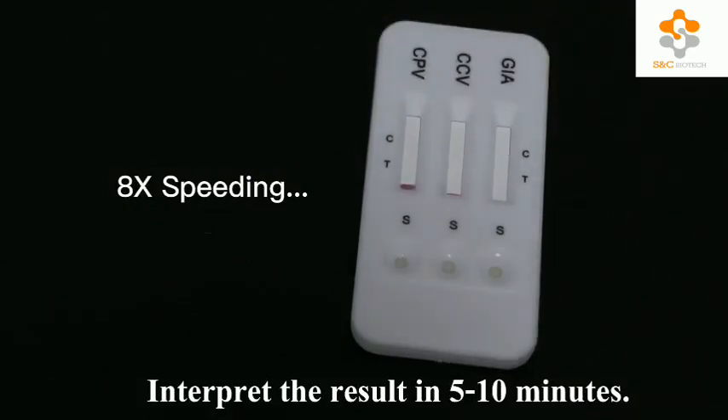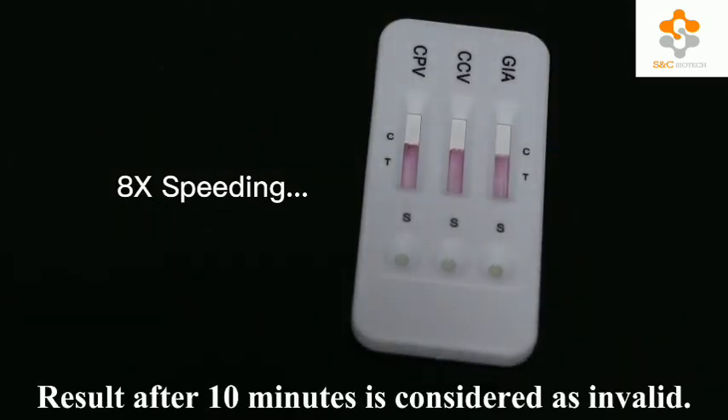Interpret the result in 5 to 10 minutes. Any result after 10 minutes is considered invalid.